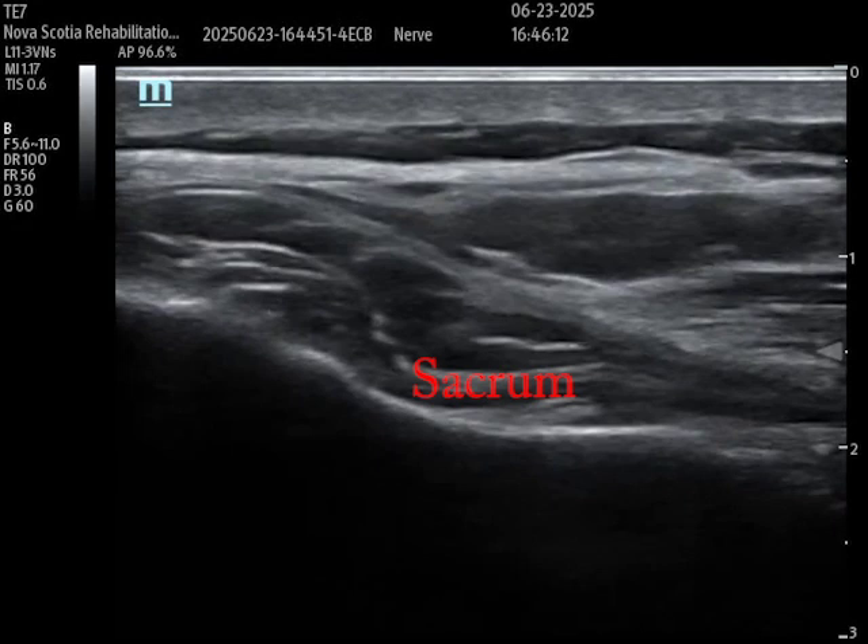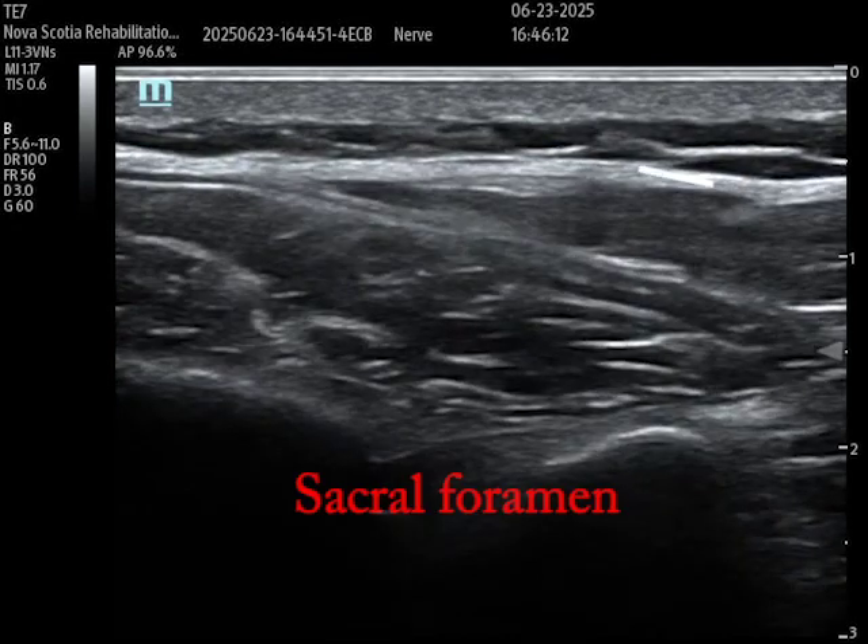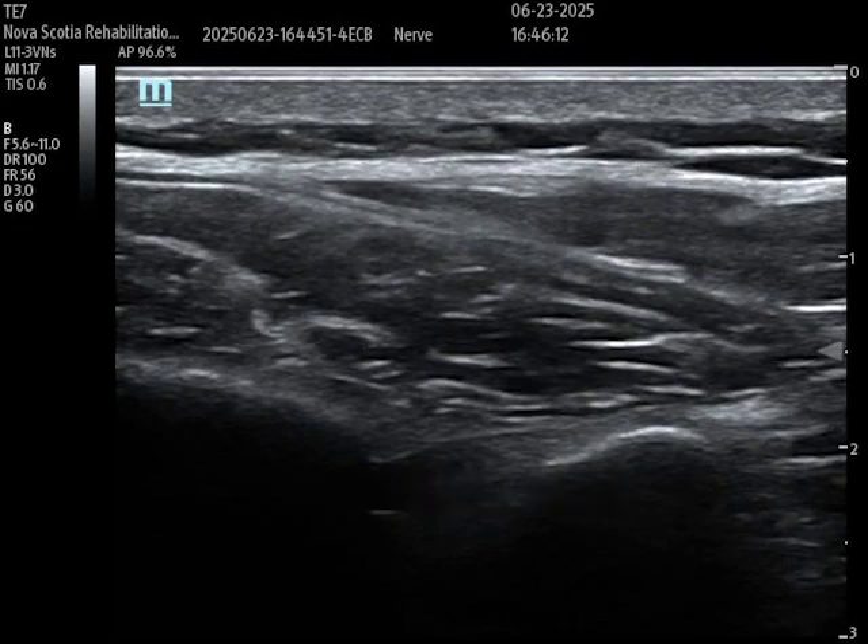From here I'm going to move the probe cephalad — cranially. Moving the probe a little bit more cranially and stopping right there. You see this area, this sort of gap — that is the sacral foramen, and it is medial to the sacroiliac joint. In a moment I'm going to move the probe just a little bit more laterally to identify that sacroiliac joint.